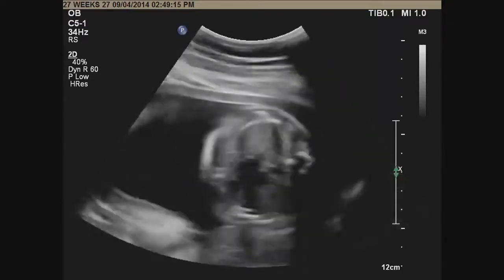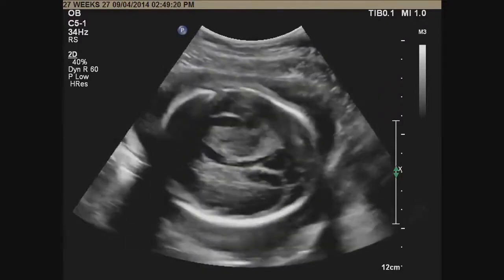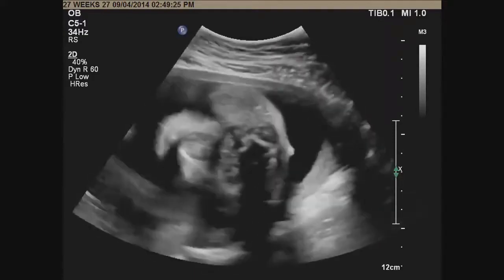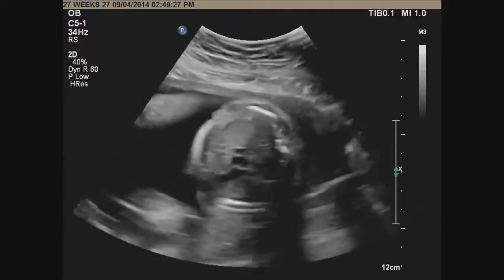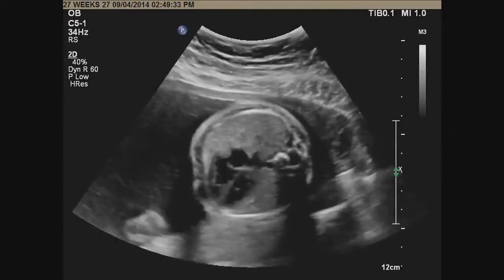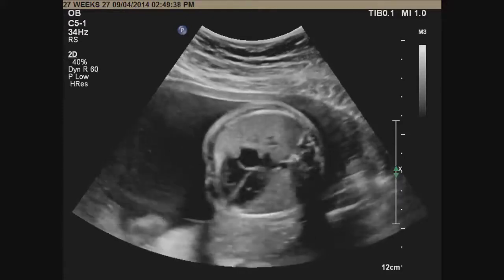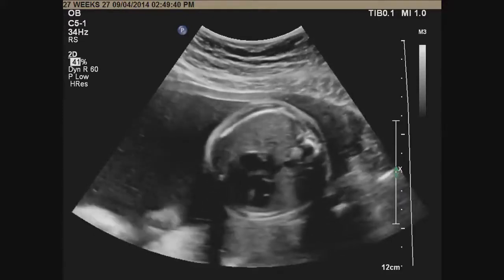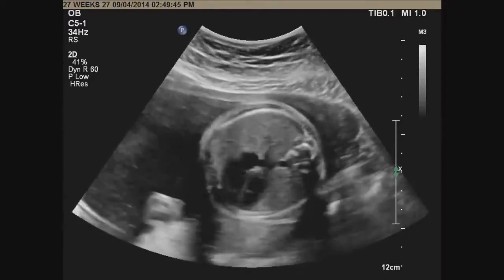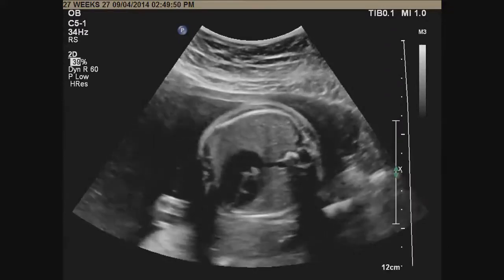So I know that the baby is in a longitudinal lie because the baby's spine is parallel to the maternal spine. After I establish the presentation and the lie of the fetus, I establish the situs, knowing here that the left side of the fetus is going to be down. So I look at the heart while I'm going down transversely now. I look at the cardiac axis also. I don't measure on every scan, but I semi-quantitate by looking at it. See, this is about 45 degrees. So this is a normal cardiac axis, and the apex of the heart is on the left side.